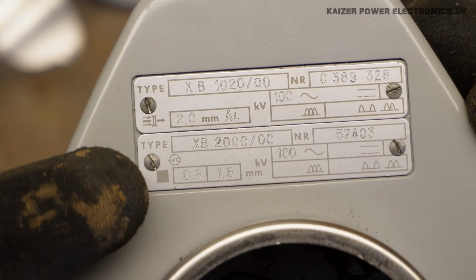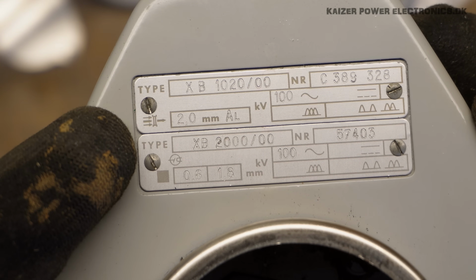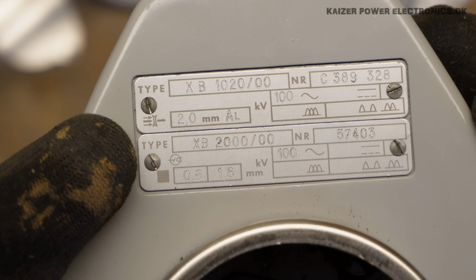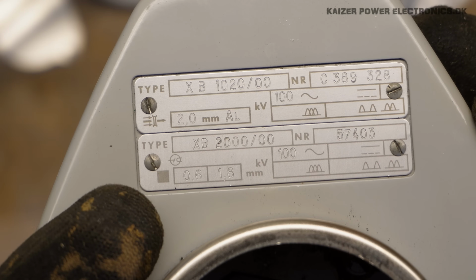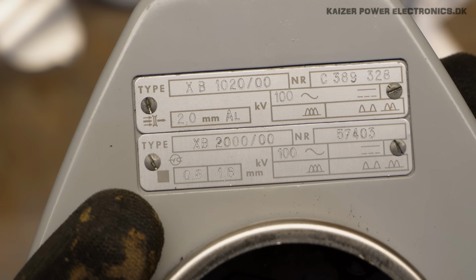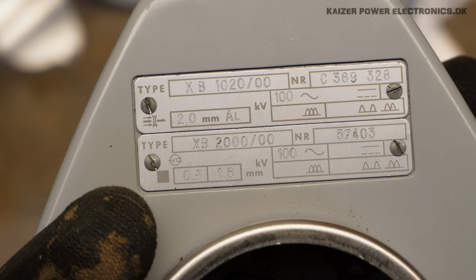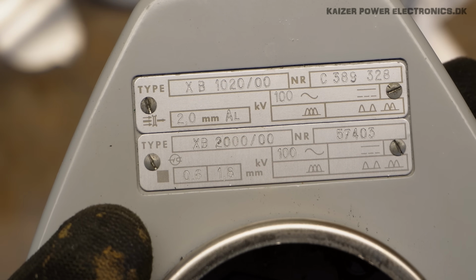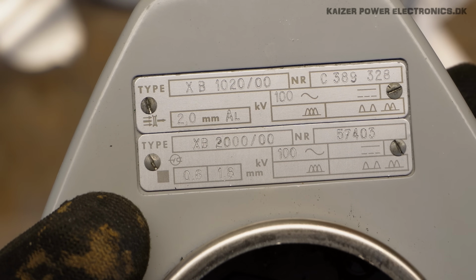There's some kind of symbol over here. We have many arrows going in, then one arrow going out, so that's some kind of filter symbol. And here we have the large square, which we saw is the large focal point. So the small focal point is probably just from the voltage and current selector along with the collimator setting.